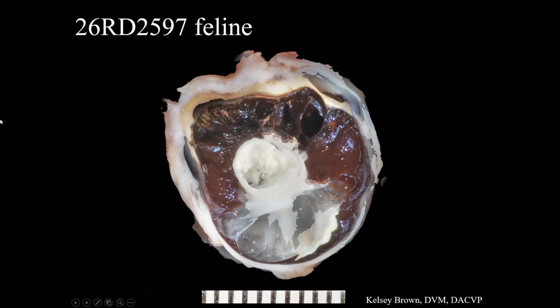So here is a picture of the gross section of that globe. There's a little bit of Photoshop artifacts, so kind of ignore these areas. But what we had noted grossly, first off, there was not a recognizable cornea. So here's our little bulbar conjunctiva, and you can see that it continues over the anterior surface of the eye. Maybe down here, there's some normal cornea, it's kind of this yellowish tissue, but we'll look at that more closely histologically. In addition to that, our iris is broadly adhered to whatever this tissue is. So we have a broad anterior synechia with collapse of our anterior chamber.